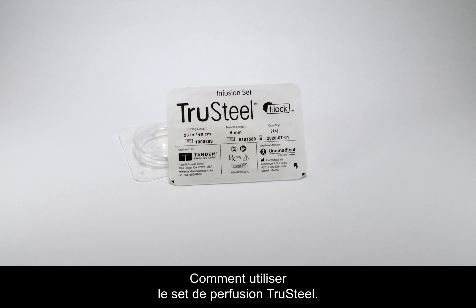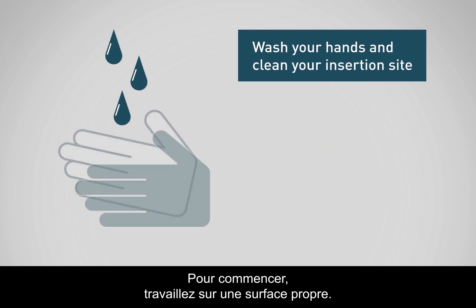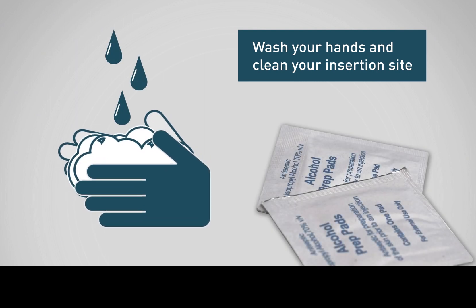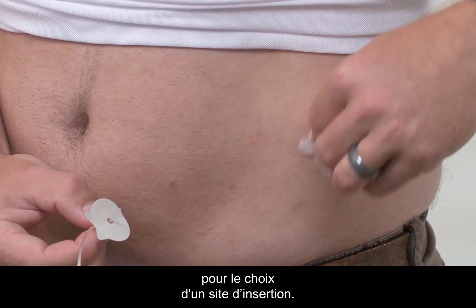How to use the True Steel infusion set. To begin, you will want to work on a clean surface. Be sure to wash your hands and clean your insertion site. Please refer to your healthcare provider's recommendations when selecting an insertion site.